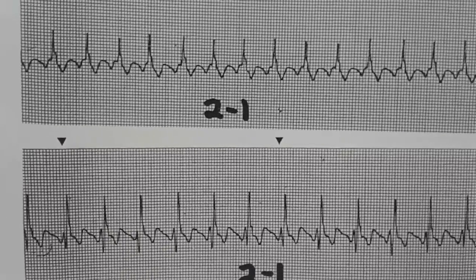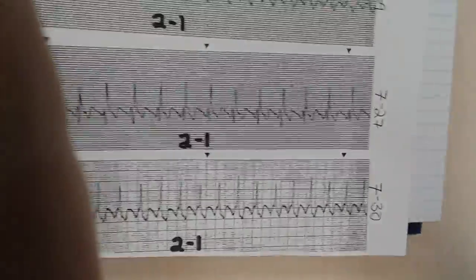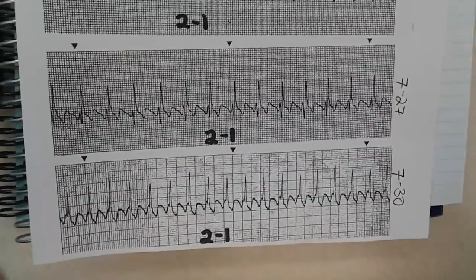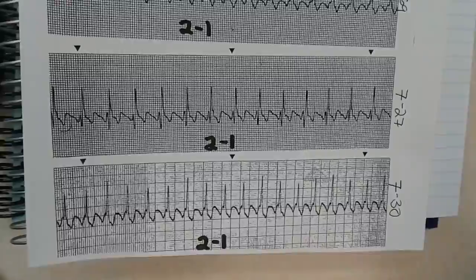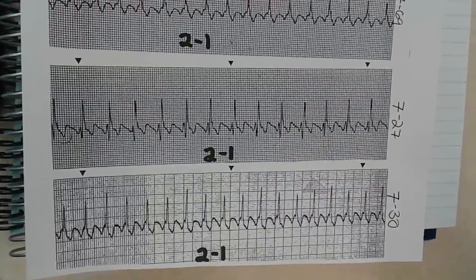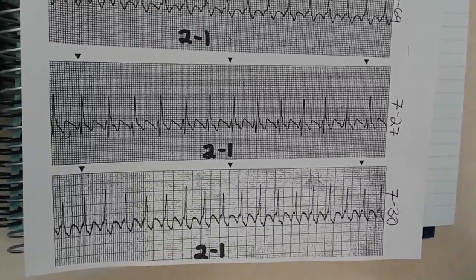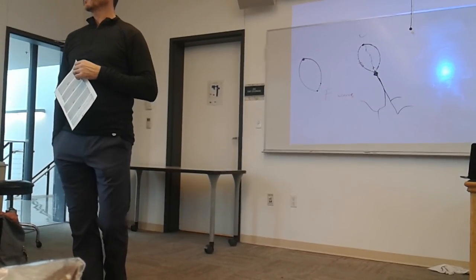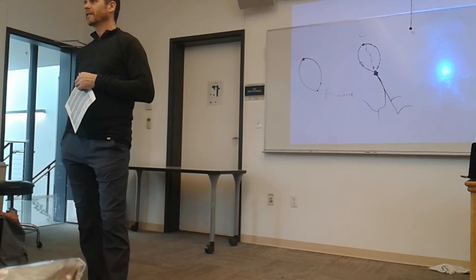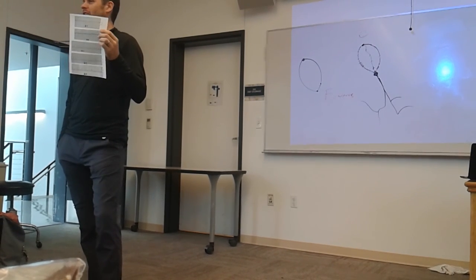If you knew which lead you were looking into, you'd have a better idea of where an isoelectric line would be. How so? Potentially. I'm just trying to think of, if I was looking at lead 2 versus lead 5. How would you know the difference? Knowing if you had a generalized knowledge of what a waveform should look like, you'd have a better idea. So it's supposed to be positive in V6. Great. And what does that say about what the baseline is? I don't know yet. You can't. That's kind of the whole point. You can't tell where that baseline is.